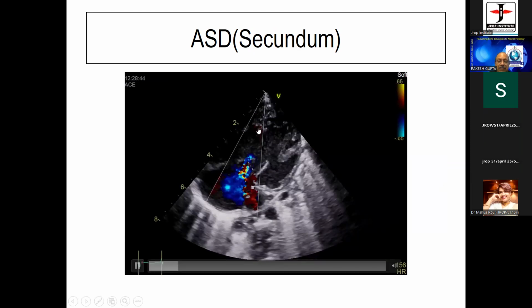It means so much blood has gone to the pulmonic system that pulmonary vascular resistance has gone up and now PA pressures have elevated. So there may be pulmonary regurgitation also with this. But this TR jet is significant and this tells you the blood is reversing from right atrium to left atrium. Okay, sir. And this is not a good sign. Yes, sir. It means that reversal of flow is happening.